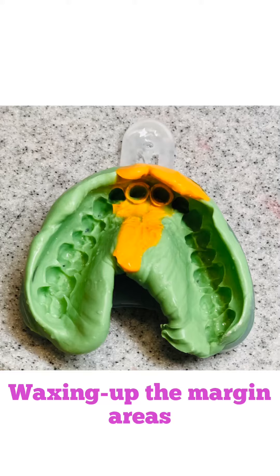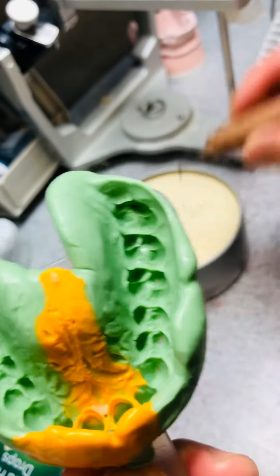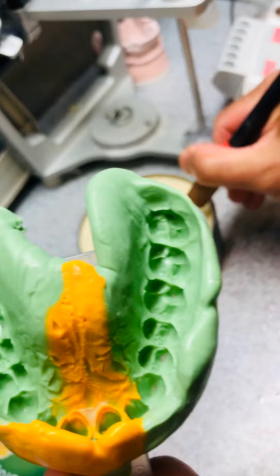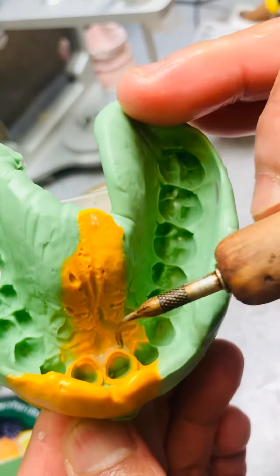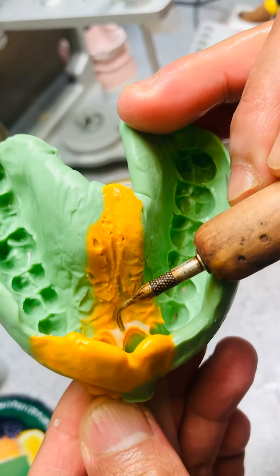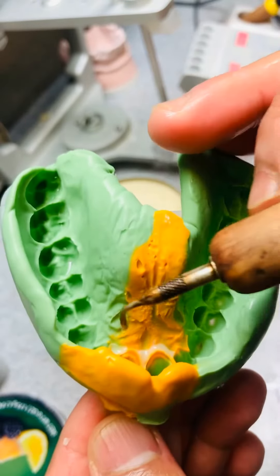I got another case, two E-max press I'm working on. Before I start, I always wax up the impressions — or wax up the margin areas — so I can repeatedly pull it up without destroying or pulling out my margin areas. That's how I protect my margin areas.